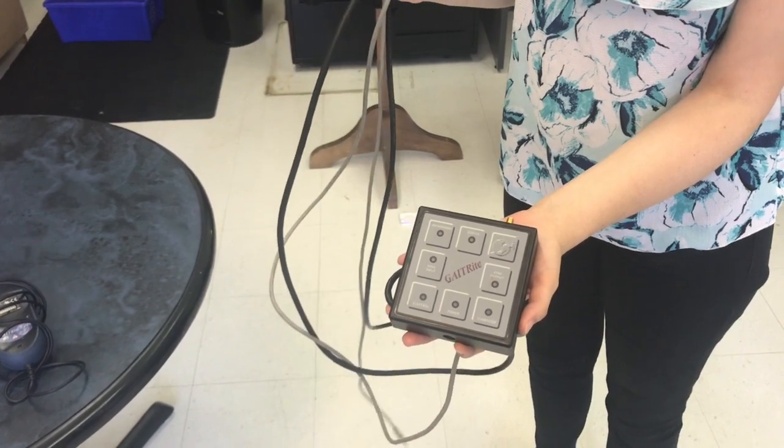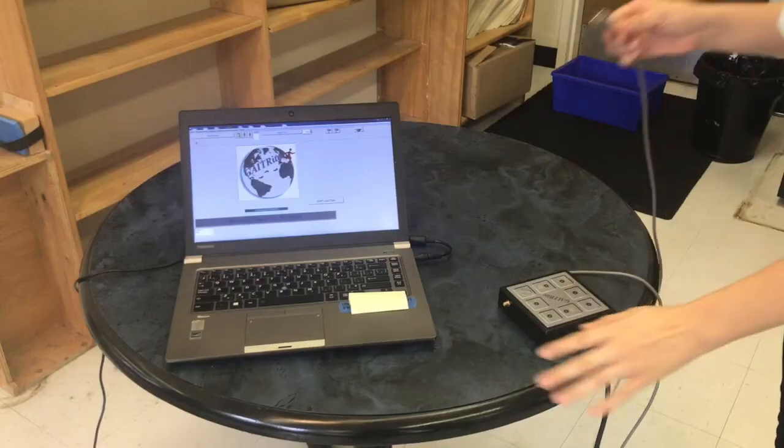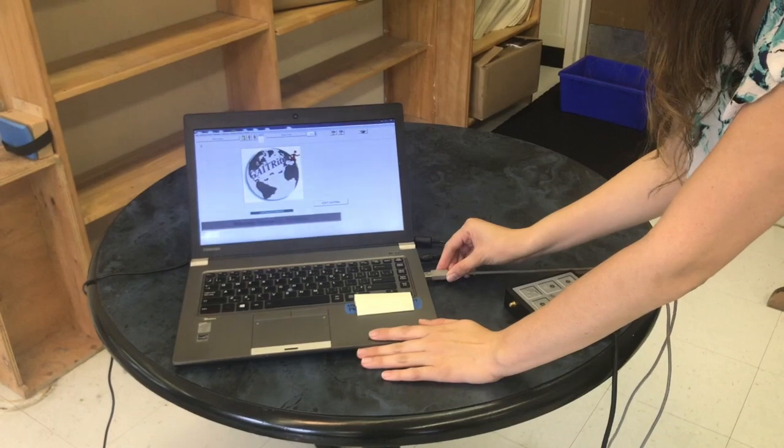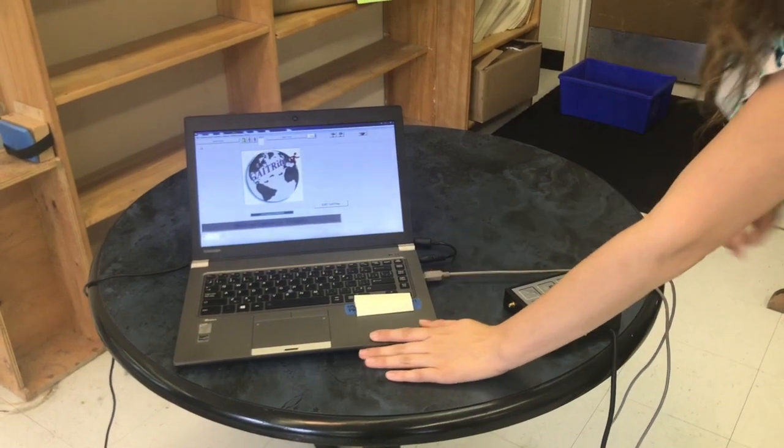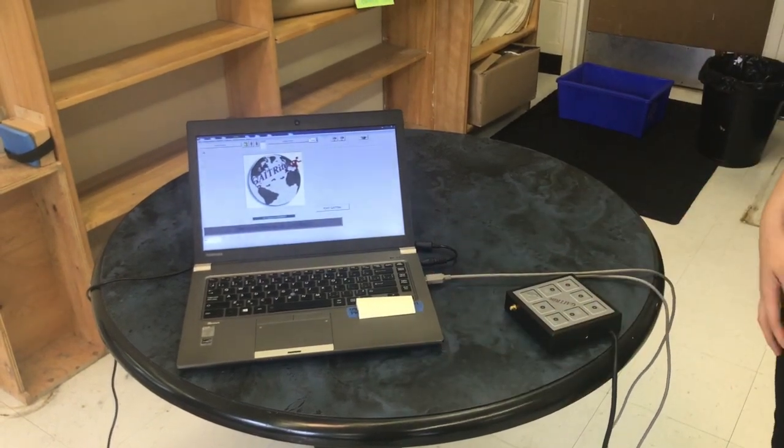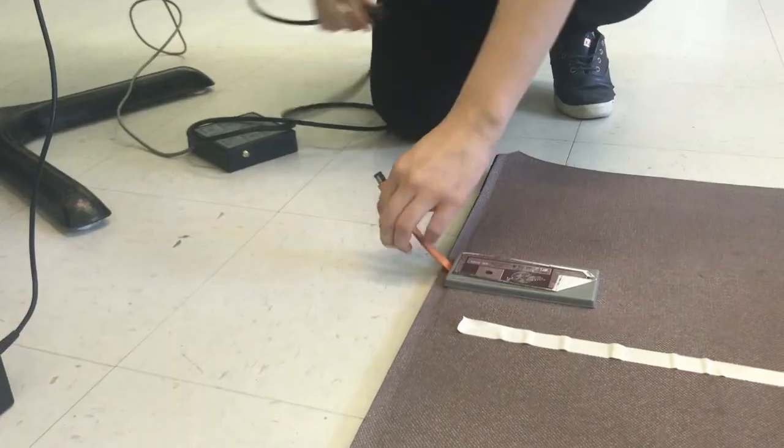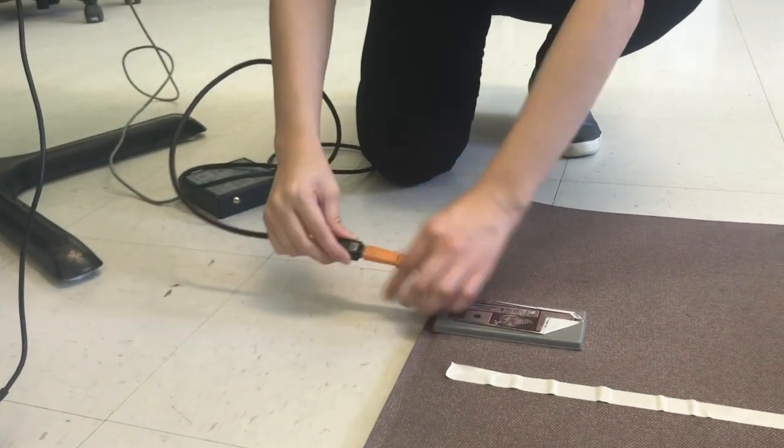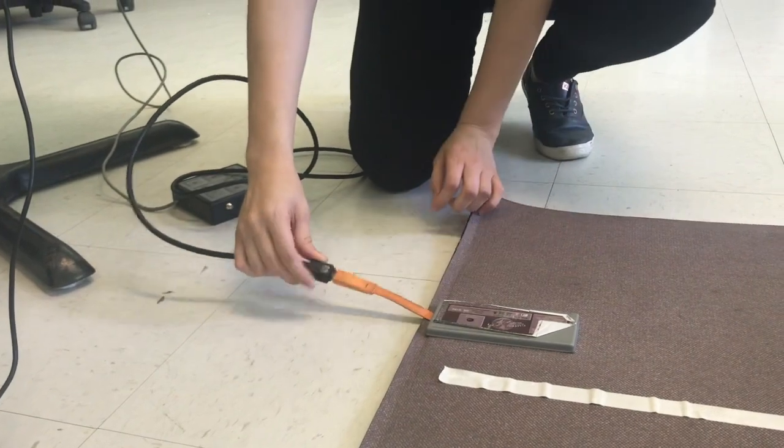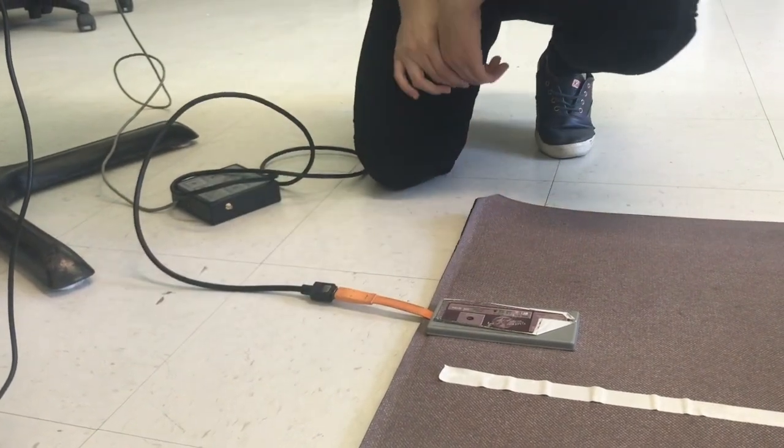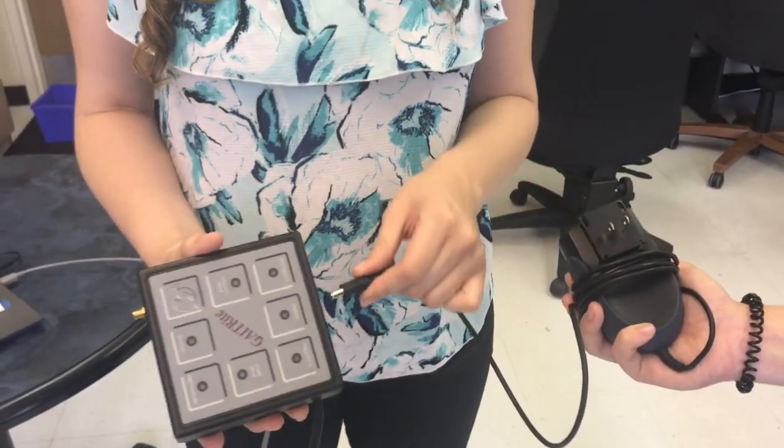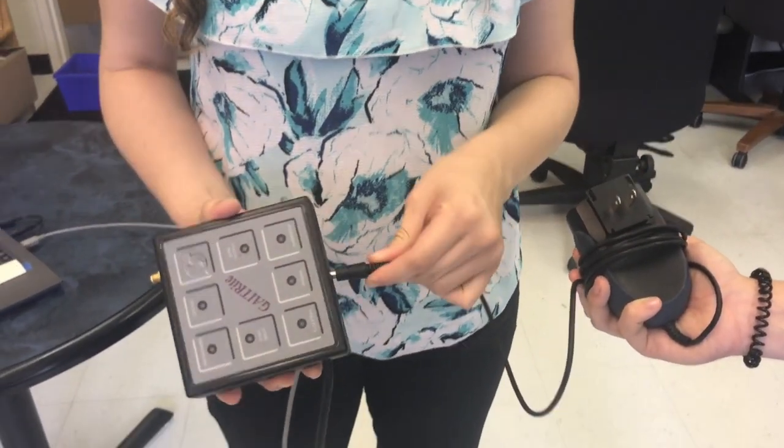Roll out the GateRite so it lays as flat and as straight as possible. Plug the connecting pieces into the GateRite and the computer and make sure to plug the GateRite into the wall. Make sure that the computer is on and the GateRite software is open and running.